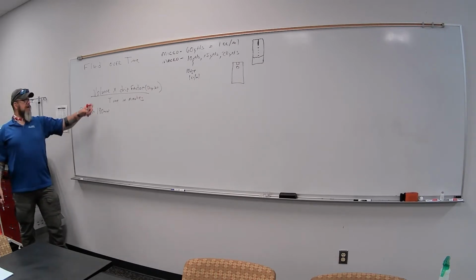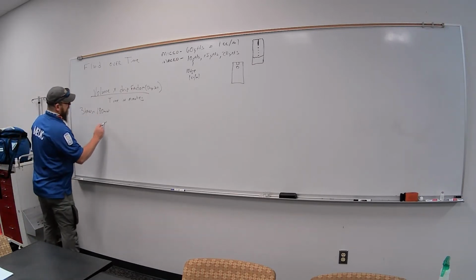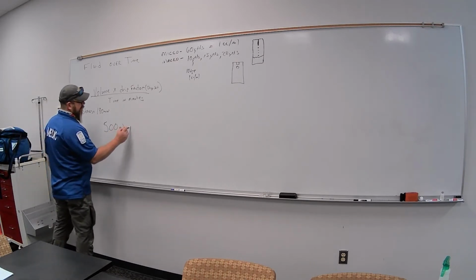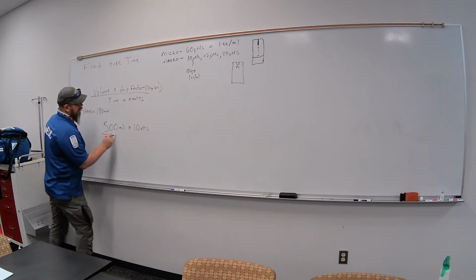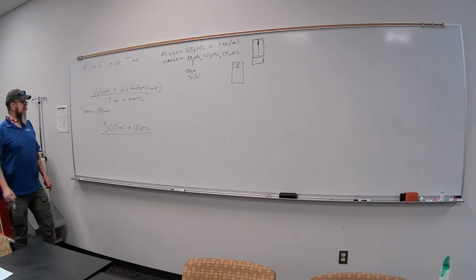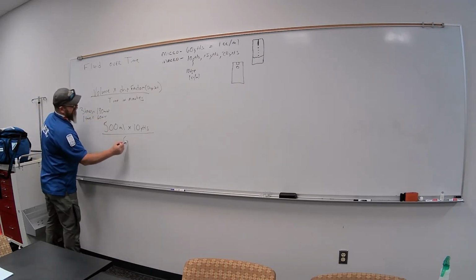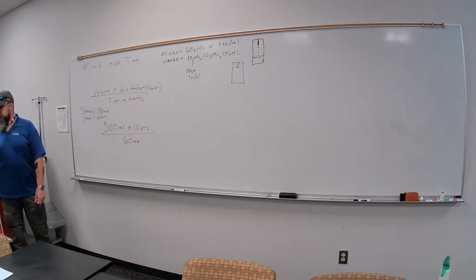Volume, how much you want to give. We'll go with the easy example here: 500 mLs. We're going to use a 10 drop set. Say we're going to give it over just 1 hour, so 60 minutes. So you put 60 down here. Everybody get it so far?